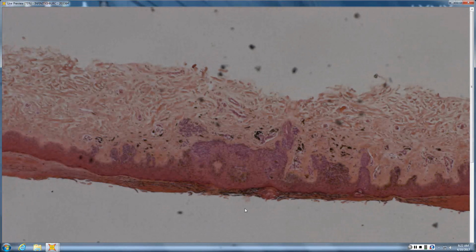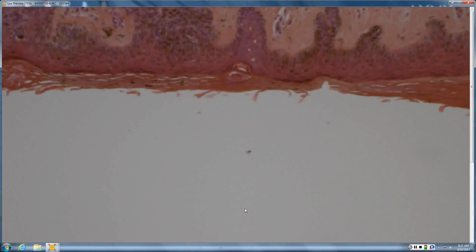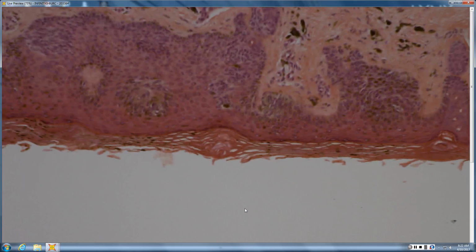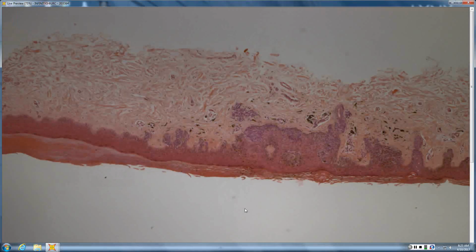Column with this little basal cell concern. Lots of pigment. Lots of pigment. And the pigment is in columns. Right. And the columns are kind of evenly spaced and similar in width. It's like an acral, just a little acral nevus. A little bit of buckshot scatter, but that's normal in acral nevi. It's small, well circumscribed. It ends in a nest. The pigment columns are similar in width, evenly spaced. So it just looks like a nevus.